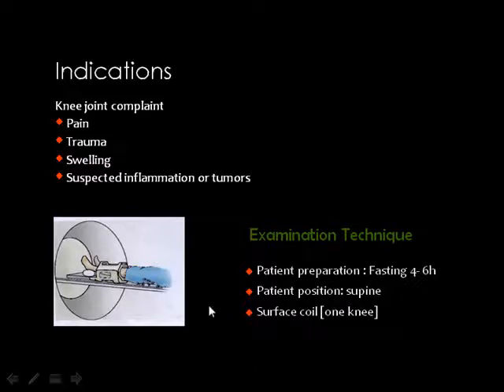What is the function of the surface coil? Yes, the surface coil is, let's say, the imager or the apparatus which can take images. If you use the surface coil in the machine itself, it will be away from the knee. Then you get very small images and bad resolution.